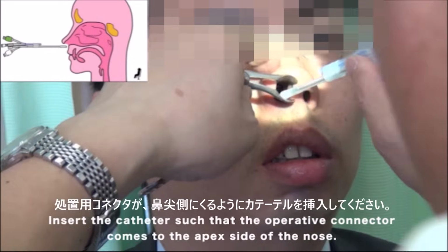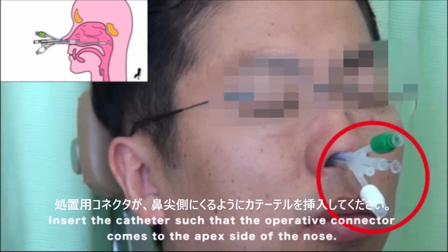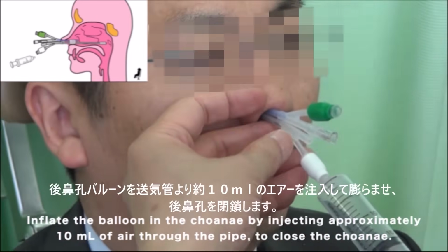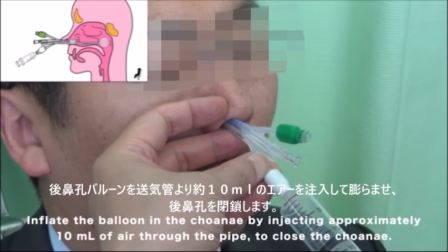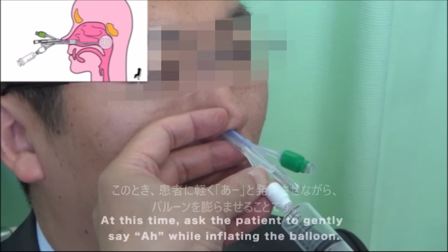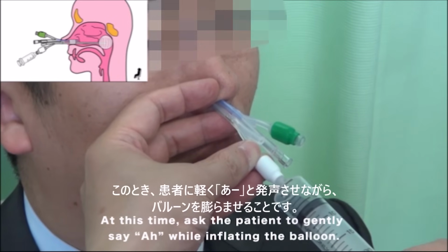Insert the catheter so that the operative connector comes to the apex side of the nose. Inflate the balloon in the choanae by injecting approximately 10 milliliters of air through the pipe to close the choanae. At this time, ask the patient to gently say "ah" while inflating the balloon.